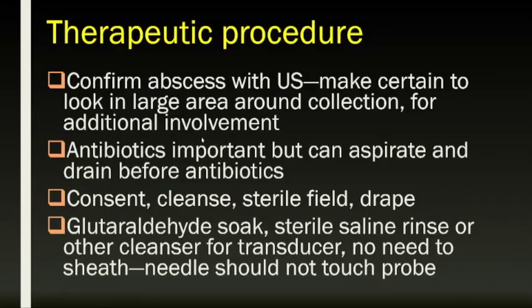effective against methicillin-resistant staph. So the therapeutic procedure: confirm the abscess with ultrasound. Antibiotics are important, but you can aspirate and drain before antibiotic therapy is instituted. Used to be thought that you needed coverage while you were doing the procedure, but you really do not.